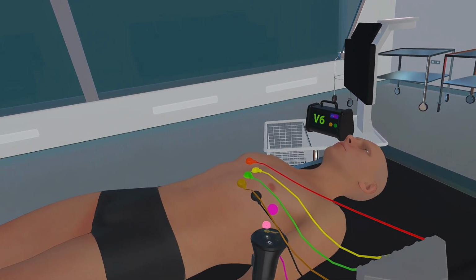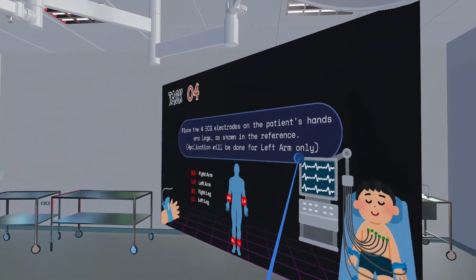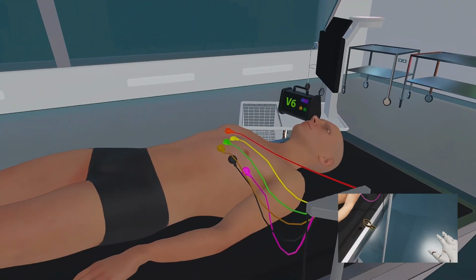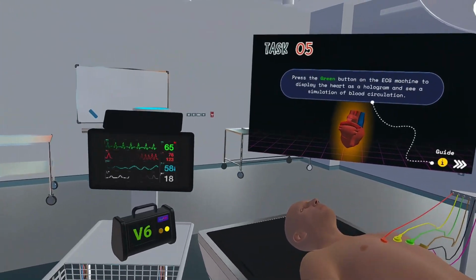Our interactive training model guides you through each step, accelerating and reinforcing your learning experience. Real machine sounds and visuals are integrated into the training to enhance your experience.